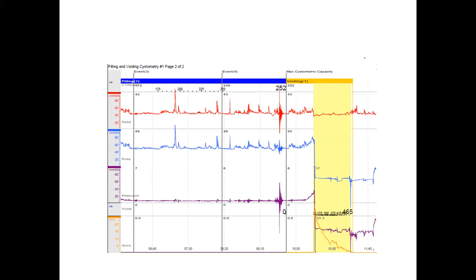Now, do you need to do anything? Is there any remedial action which needs to be taken? In this case, if your urodynamic question relates to the voiding phase of urodynamics, then yes, there is, because you haven't actually been able to answer anything.